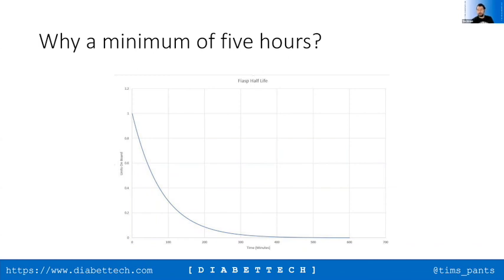But that's going to cause a level of confusion as people start to use the 780G, and then you'll have potentially DSNs and doctors going, why are you using 5, 6, 7 hours? It's 2 hours. That's what Medtronic say. It's like, well, Medtronic's algorithm isn't looking at the same thing. It's a variable that they use. It's not actually the physiological model that we're using, and by the way, that Tandem use in their setup. So that is going to cause a level of confusion for people.